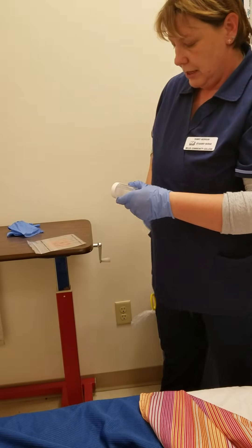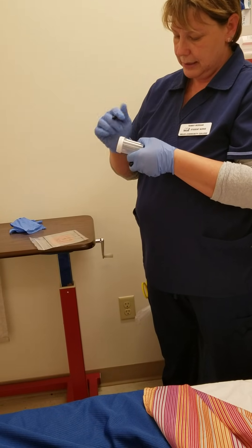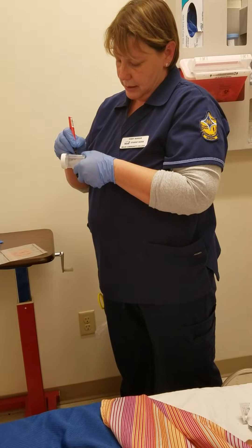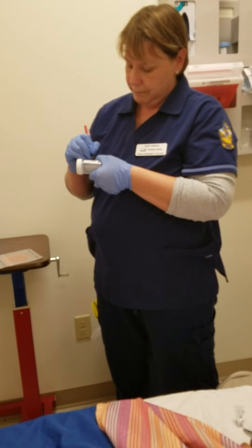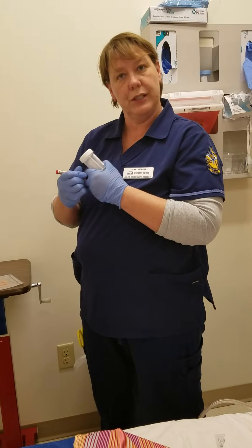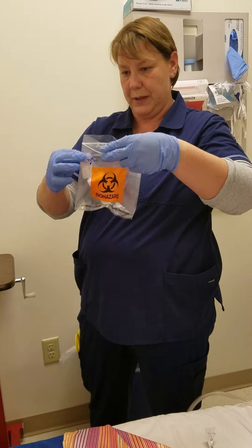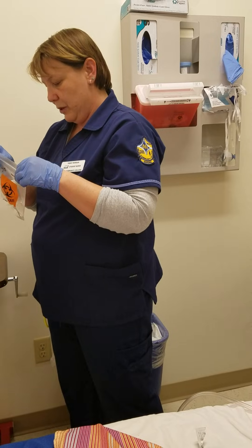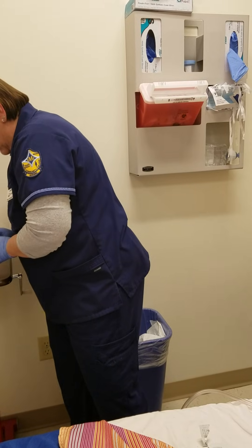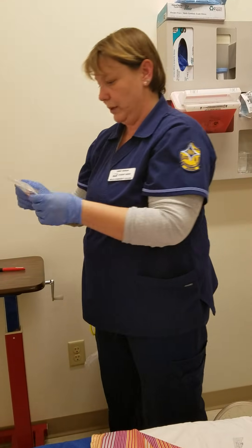I'm going to write the name of the patient — Jose — the date, the time which is now 16:57, the name of the doctor, and the instructions for the urine sample. Once I'm done with that, I'm going to put the urine sample in this biohazard specimen bag. I'm also going to fill out a lab slip with the name, date, and all the required information and instructions for the sample, and place it inside the specimen bag on the outside.